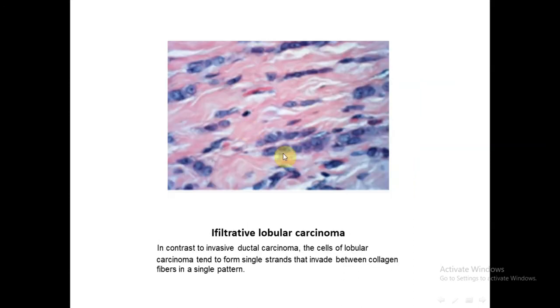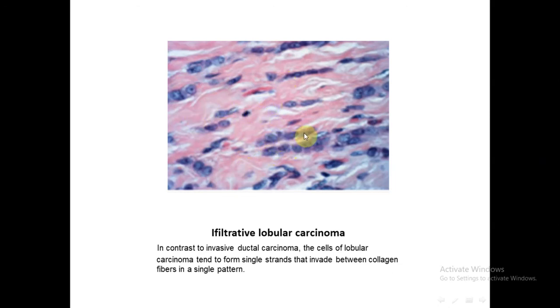This is invasive or infiltrative lobular carcinoma. In lobular carcinoma, the cells do not form any glandular or ductal structure. They are small single cells, and the specific diagnostic feature is the Indian file pattern — arrangement of tumor cells one behind the other in a single cord with no glandular structure formation. Sometimes signet ring cells and mucin production can be seen. The stromal fibrosis is minimal, and the tumor cells tend to be small, uniform, round shape with only little pleomorphism.